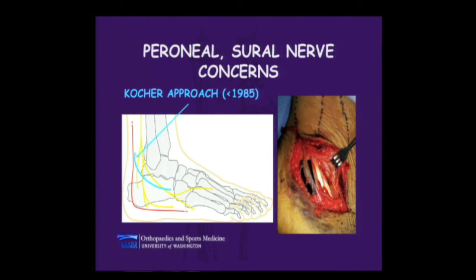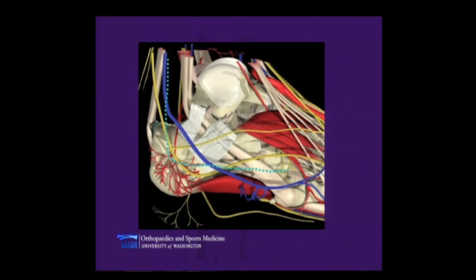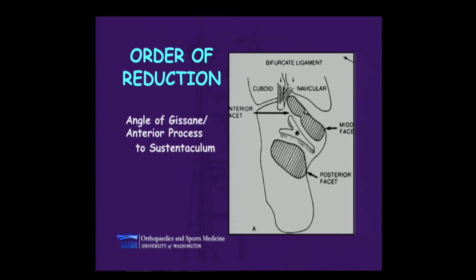Unfortunately, we had the discouraging view of a number of structures we didn't really want to see, the sural nerve and the peroneal tendons, many of which would granulate in at the time of closure of the wounds because the soft tissue envelope was very precarious in this area. So we evolved to this more extensile approach where you are doing a J or an L, doing a periosteocutaneous elevation of all of the structures on the lateral side, including the peroneal tendon sheath.